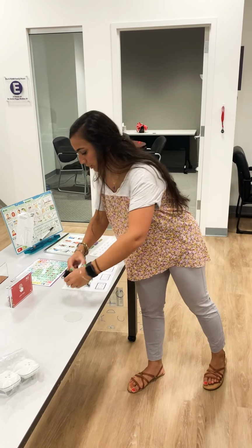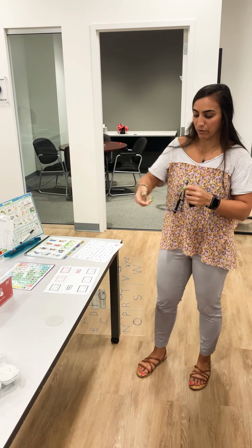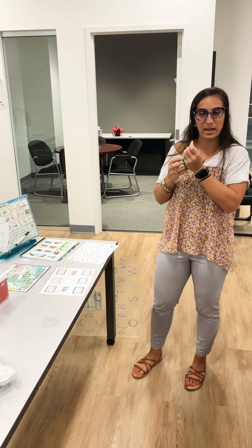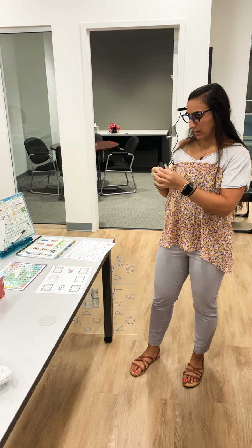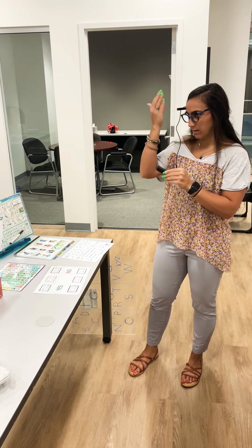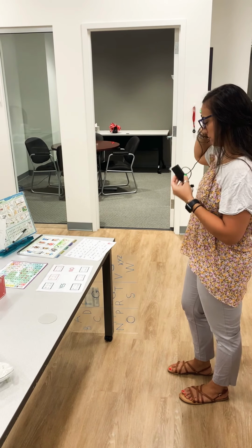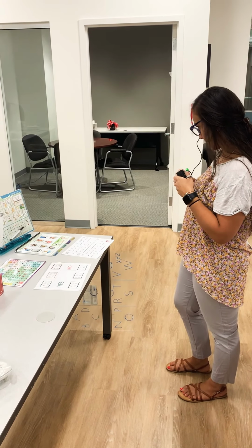And another option for patients who want to make a selection on their own, if they still have head and neck movement, they can use something like a head-mounted laser. And once you turn the laser on, you have a red laser pointer, so you can lie in bed and use this to make a selection, and you can point with the laser at whatever you want to select.